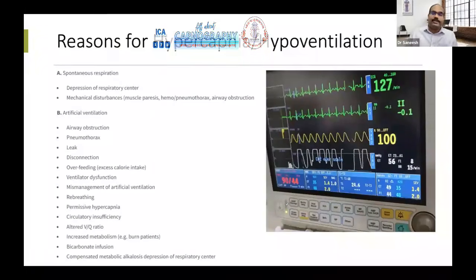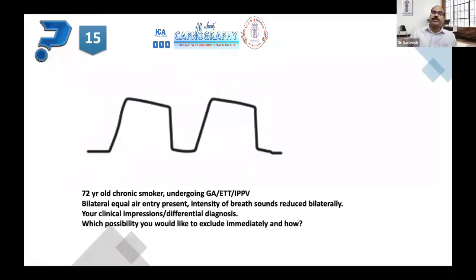It can also contribute to negative cardiopulmonary impacts, and it can lead to hypercapnia and raised ICP also. So either way, it's not required. But we'll discuss towards managing ETCO2 trend in the ICU patient, because sick patients, it's a different ball game, and you need to be more vigilant about controlling your ETCO2 values. So we'll move ahead with the next scenario.